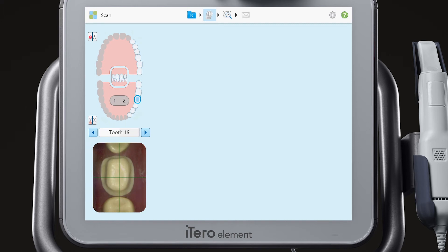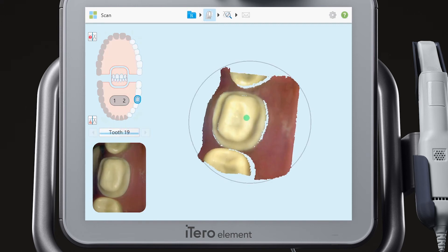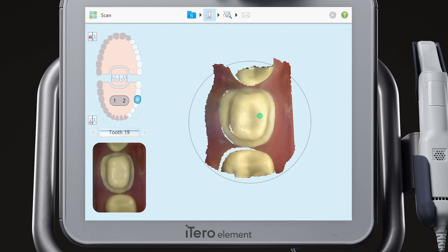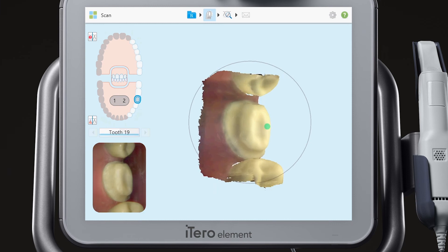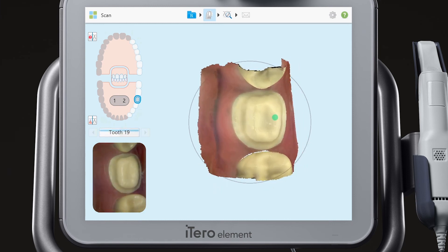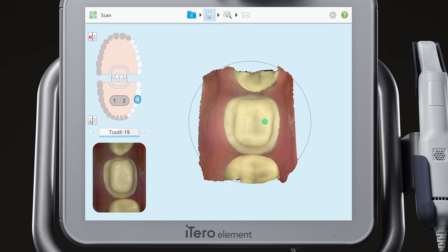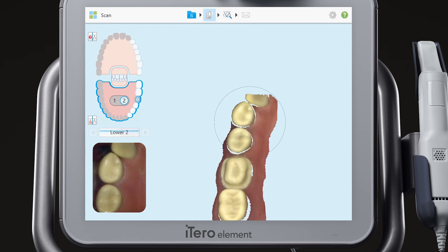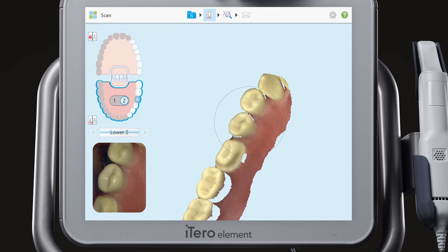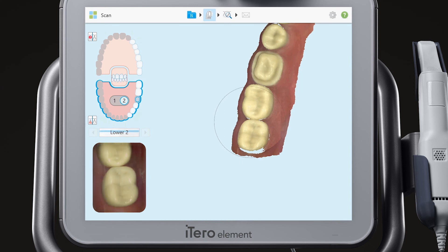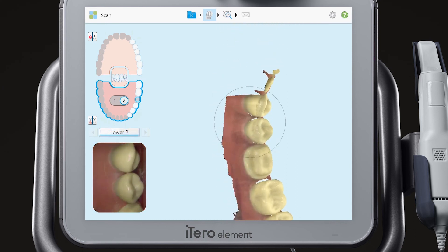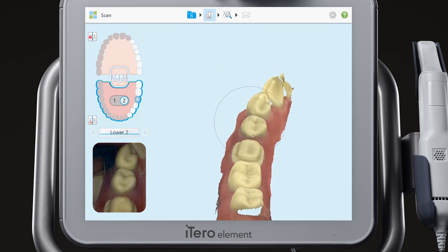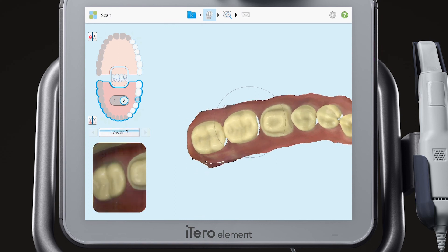Continue by prepping the appropriate teeth. When you are ready, scan the occlusal, lingual, and buccal of the prepped tooth, and then the occlusal, lingual, and buccal of the prepped arch with adjacent contacts. Notice that the background on the scanner screen is blue. This signifies that you are in the prep jaw scanning segment.